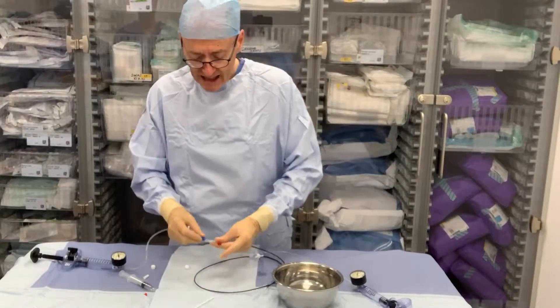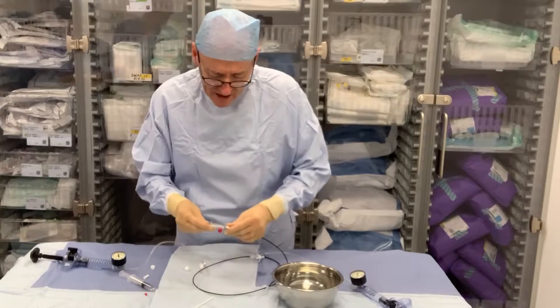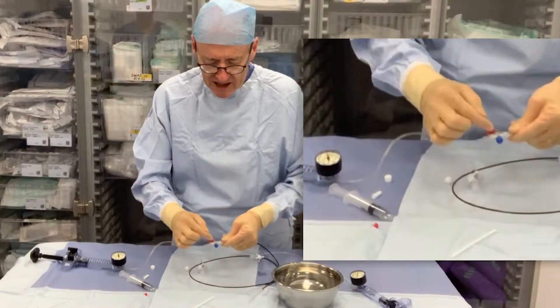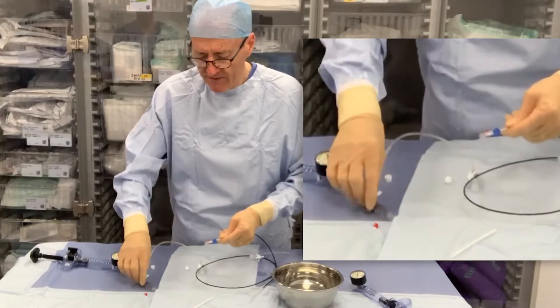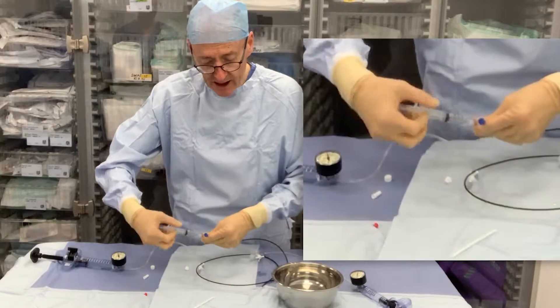This is the new Gemini balloon from Androtec. You can see there are two inflation ports — one for the inner balloon, marked in blue, and one for the outer balloon, marked in red. They're all part of the same hub with the guide wire lumen in the center, so we just prep the balloon by flushing the guide wire lumen.